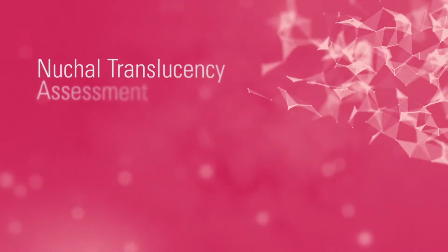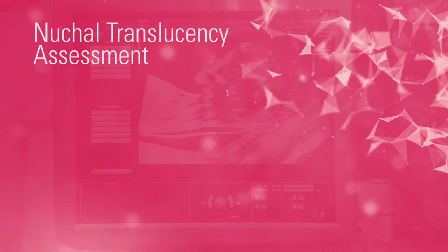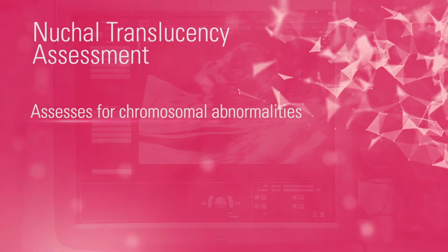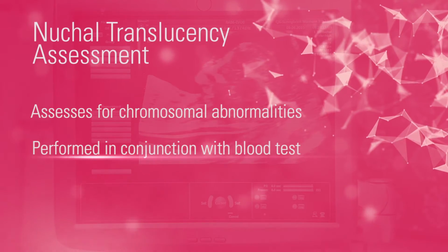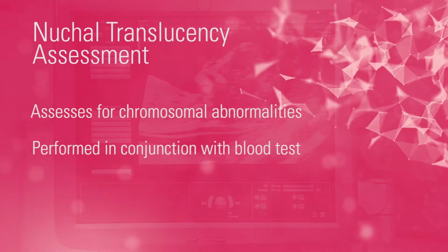The next scan you may be referred for is called a nuchal translucency assessment. This is a specialized scan performed to assess for chromosomal abnormalities and is done in conjunction with a blood test. We have a special video dedicated to explaining this scan.